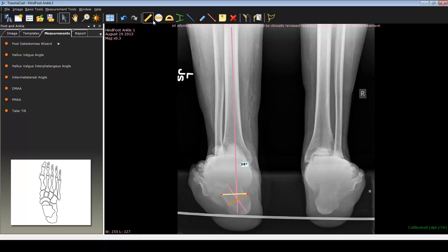Once that is done, I like to measure those points. It tells me that about 20 millimeters of bone wedge has to be removed for these deformities to be corrected by strictly a closing wedge osteotomy.